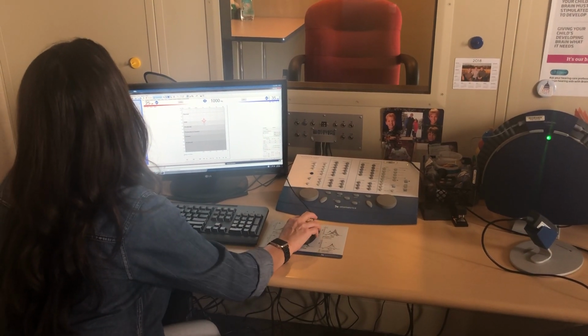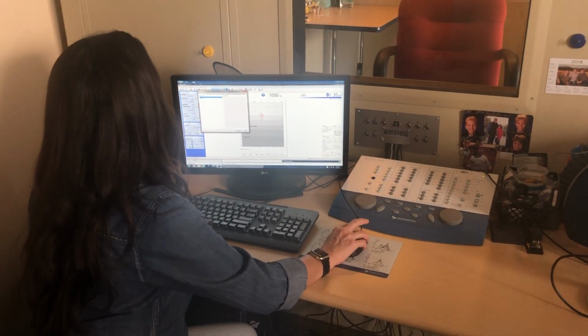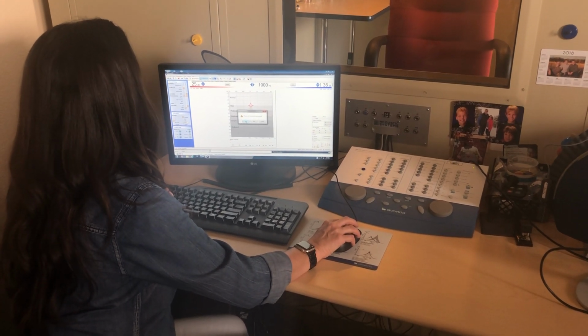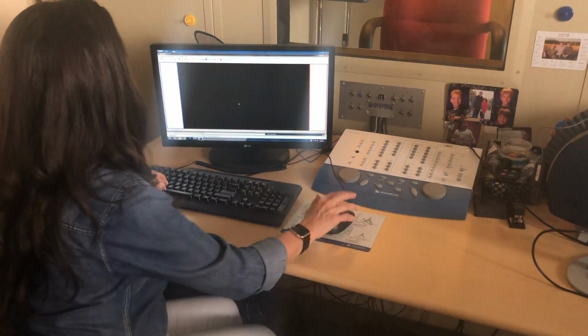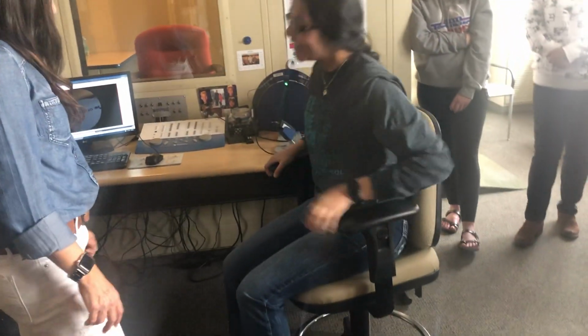One other thing I want to show you is otoscopy. We have the video otoscope, so you guys get to practice with this as well. Somebody sit in the yellow chair for me, and I'll demonstrate. Whoever wants to have their ears on TV. Somebody? Nobody? I will. Oh, good, thank you.